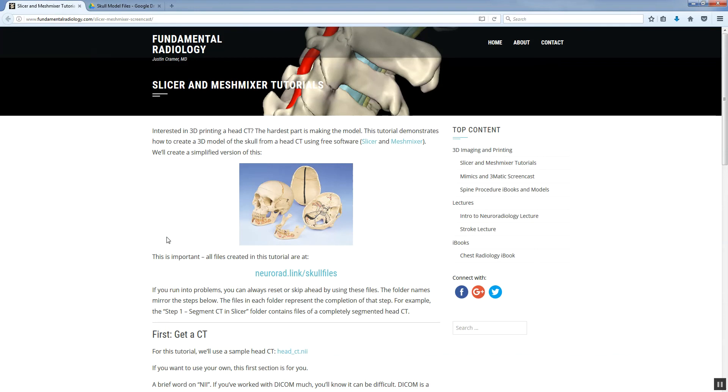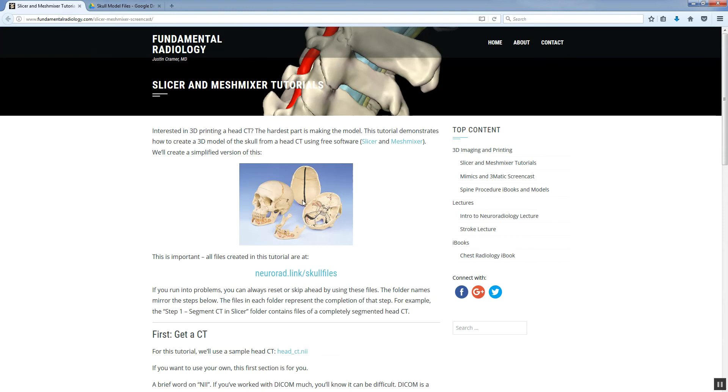This walks you through all the different steps of the tutorial, linking to all the different videos. We use Slicer and MeshMixer as the software to create the model that we want to end up with here, which is a standard anatomical skull model where the skull top pops off. First step is to make sure you have those two pieces of software installed on your computer.